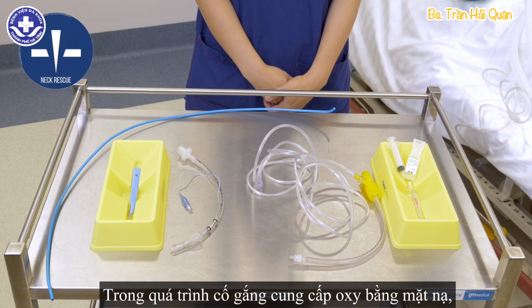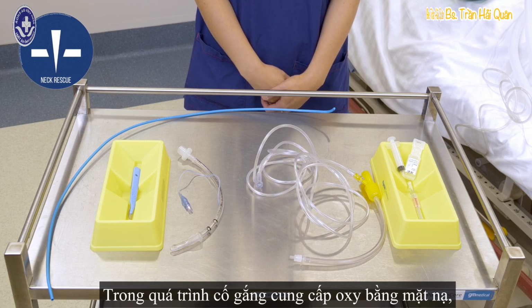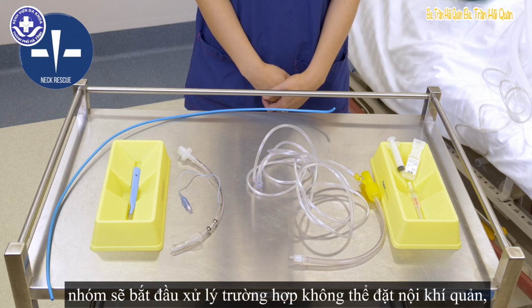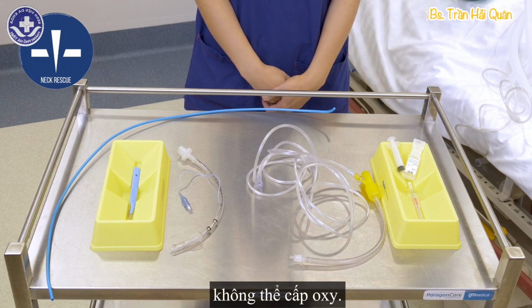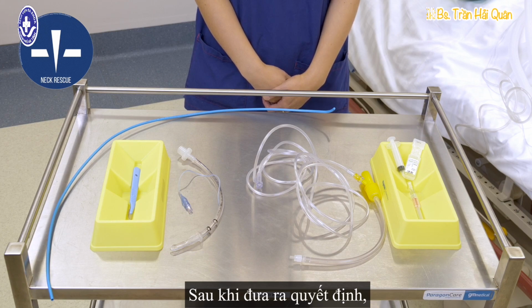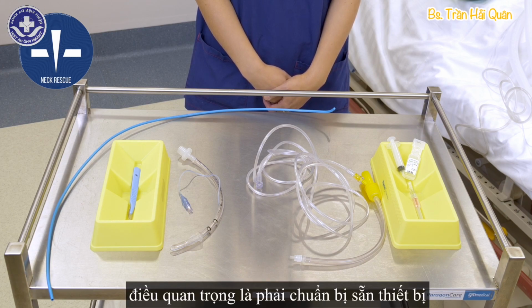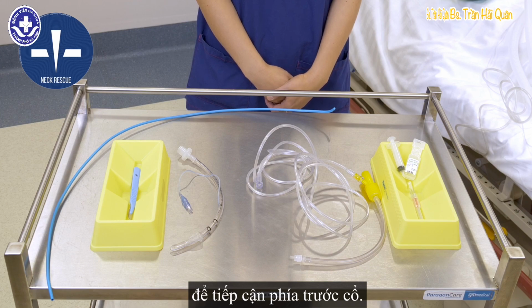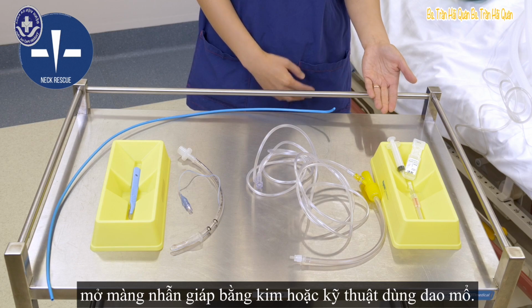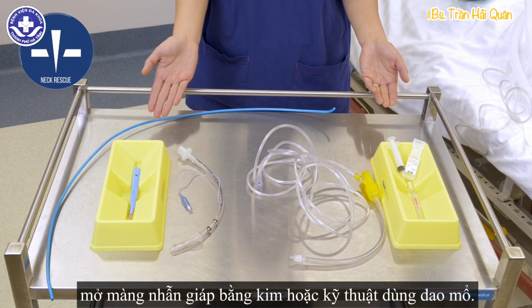During attempts to oxygenate using the face mask, supraglottic airway and intubation, the team will start to prime for can't intubate, can't oxygenate rescue. Once the decision is made, it is important to have the equipment ready for front of neck access. This would include equipment for either a needle cricothyroidotomy or a scalpel bougie technique.